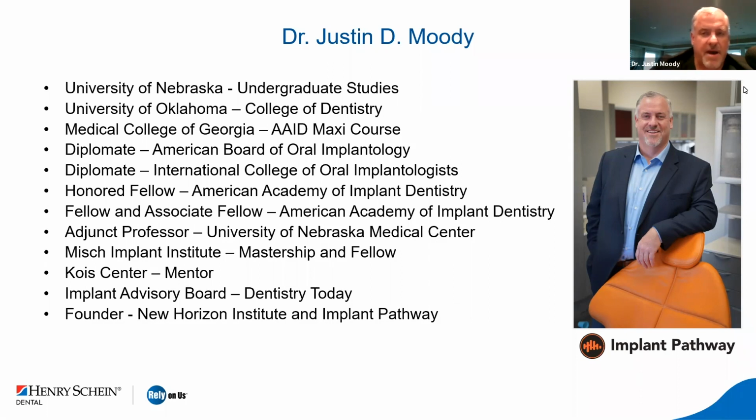At New Horizon Institute and Implant Pathway we have a clinic that places about 8,000 dental implants a year, courtesy of companies such as Henry Schein, BioHorizons, Sprintray, Meisinger, things like that. And what it allows us to do is really work on some key workflows and digital key pieces that hopefully bring efficiency.